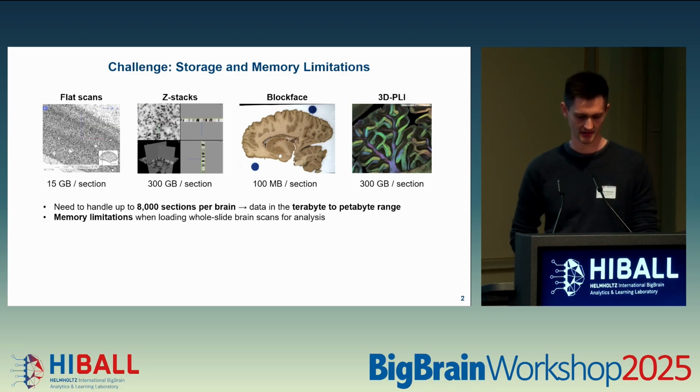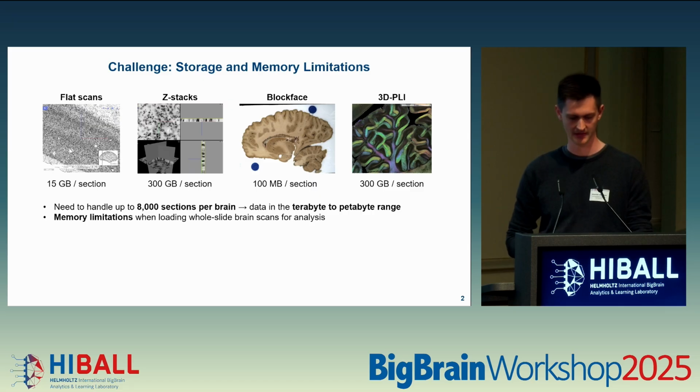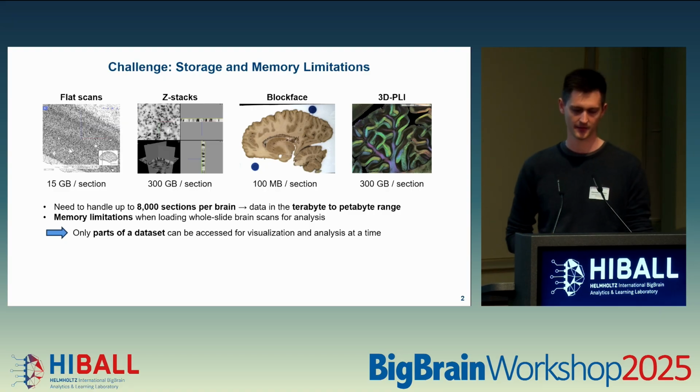And this already shows us a problem that we face, because usually on computing infrastructure, we don't have this size of memory. So we are dealing with memory limitations when holding these whole slide scans for analysis or processing. Which basically means that we can always only access parts of the data at a time for visualization or analysis.